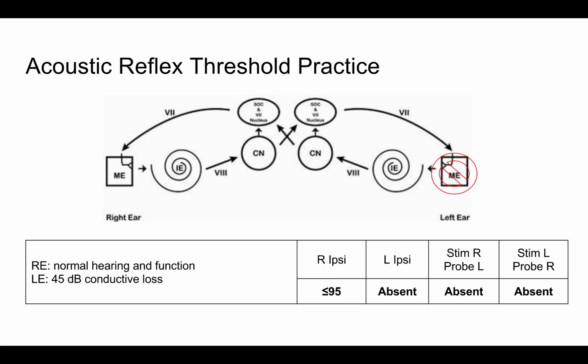Okay, I wanted to go over some things on the acoustic reflex threshold practice worksheets that I had uploaded to Blackboard. So I think you guys downloaded those and then you tried to go over those to get the answers, and you downloaded the answers, and then you maybe had some difficulty figuring out why the answers were what they were. So I'm going to try to explain that to the best of my ability here in the short amount of time that we have.